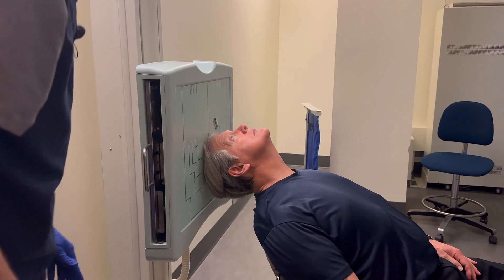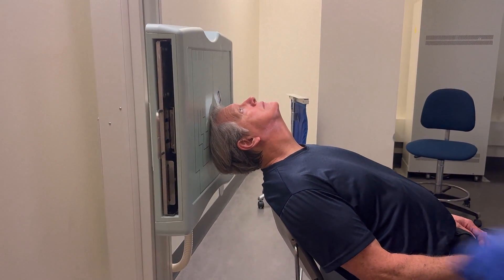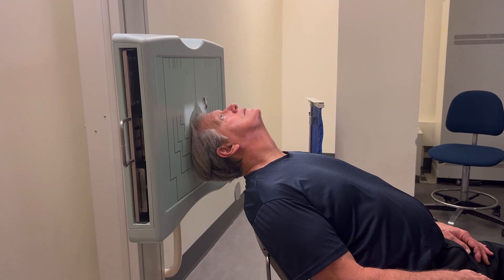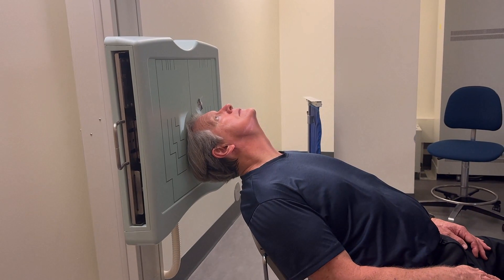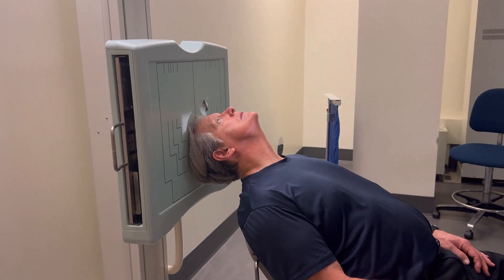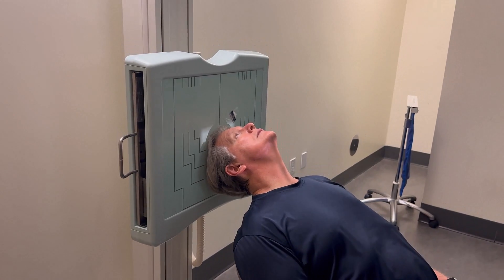This is not easy for your patient, so try not to leave them like this for very long. You want to be very efficient when positioning for this. I'm going to have my central ray going about an inch posterior to the outer canthus, but I can frame this between my two landmarks — the patient's cheekbone and the EAM.